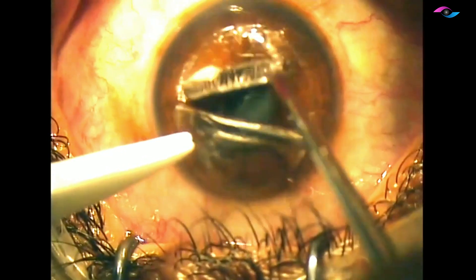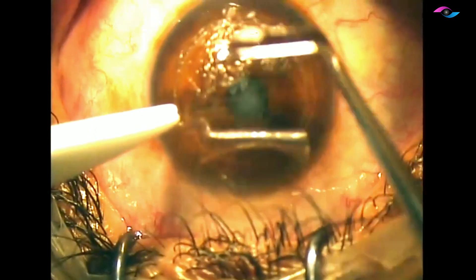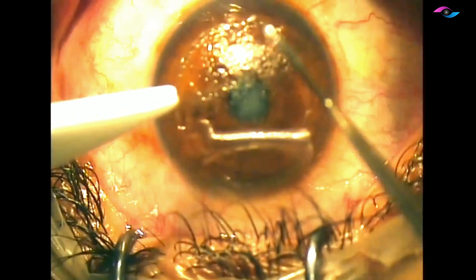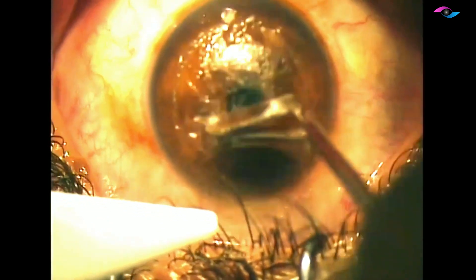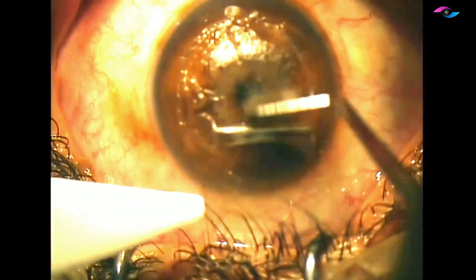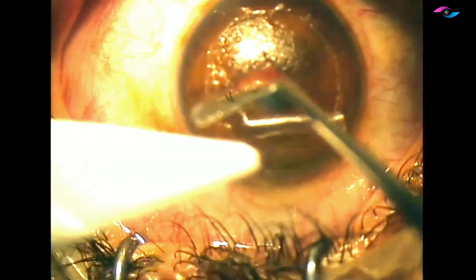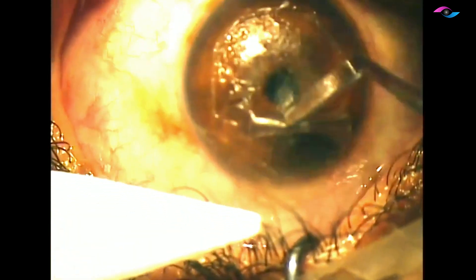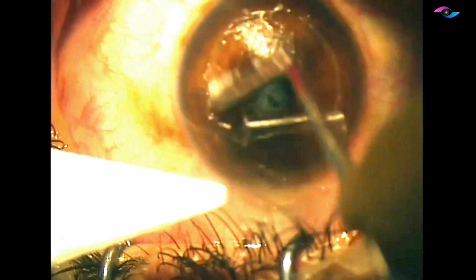Epithelial ingrowth is nothing but epithelial cells going inside the LASIK interface and causing blurring of vision when they start encroaching the pupillary border. It is important that we clean them up very nicely so that they don't recur, as they have a tendency to recur in these patients. I'm using a hockey stick and making sure we get rid of all of these epithelial cells on the stromal side first.